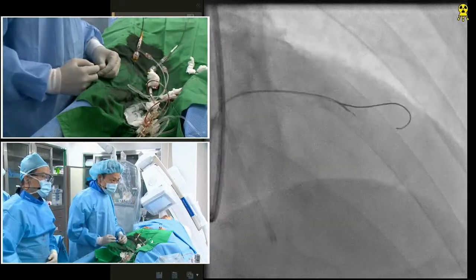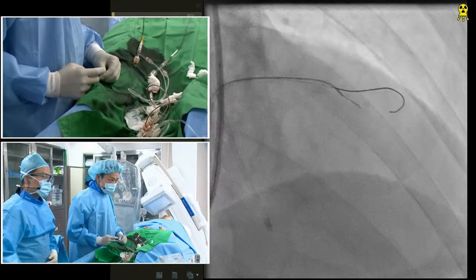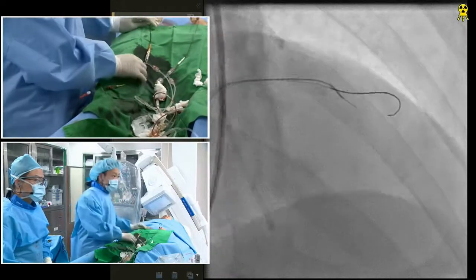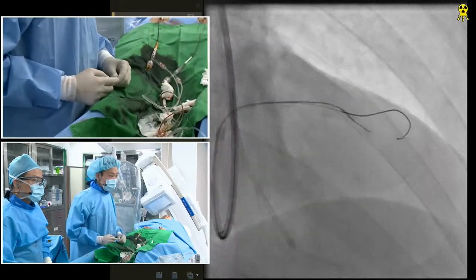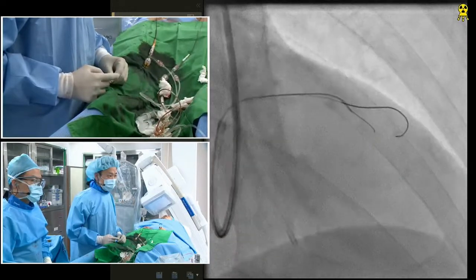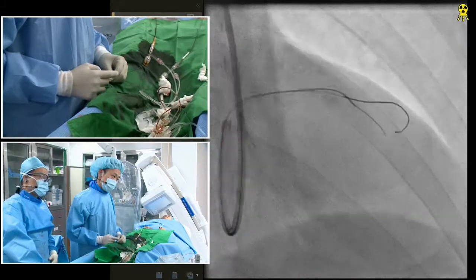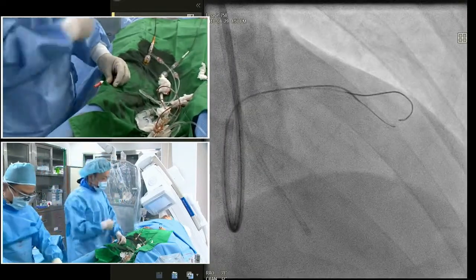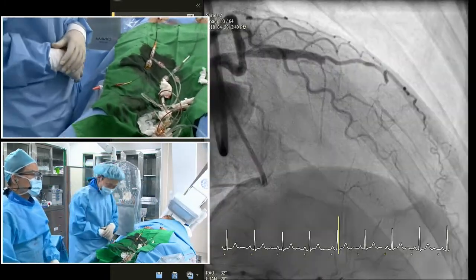But I want to push the wire a little bit more. Yeah, a little more. Oh, looks good. A little bit more. Okay, very nice. Okay, check the right caudal and the left cranial. Gaia Next is more controllable than Gaia previous. Yes, this is Gaia 1.